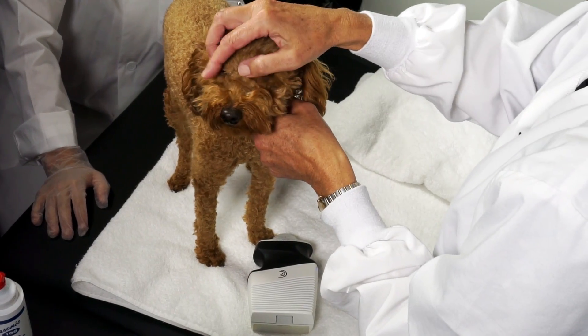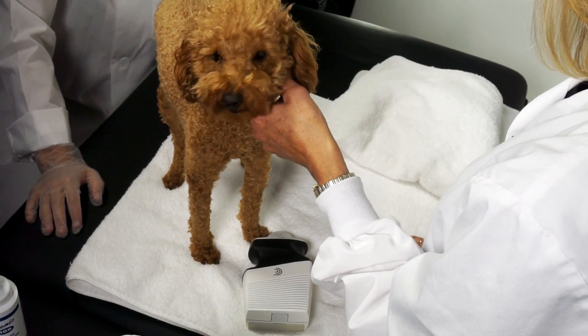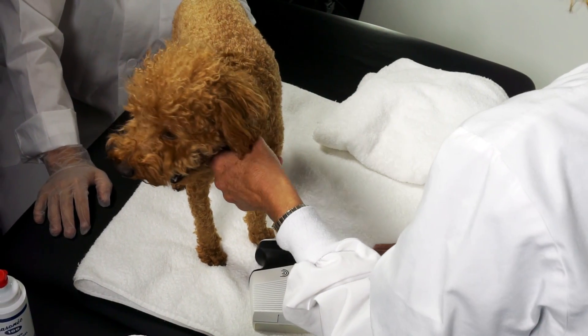Hi, my name is Gail. I'm a registered ultrasound sonographer. Today we're going to use the Clarius ultrasound scanner to do a FAST scan on small animals. The FAST scan stands for focused assessment of sonography in trauma.